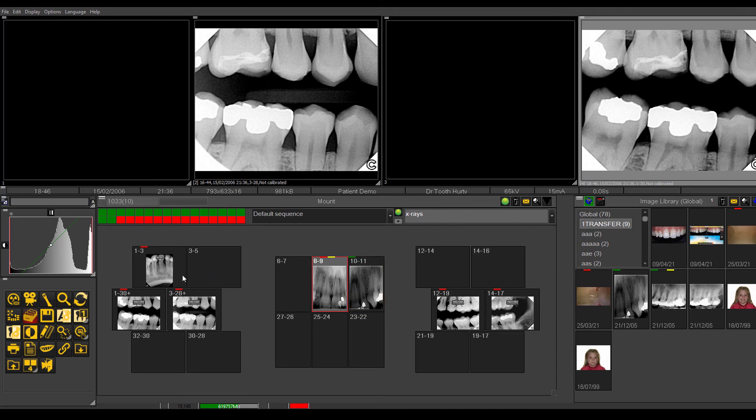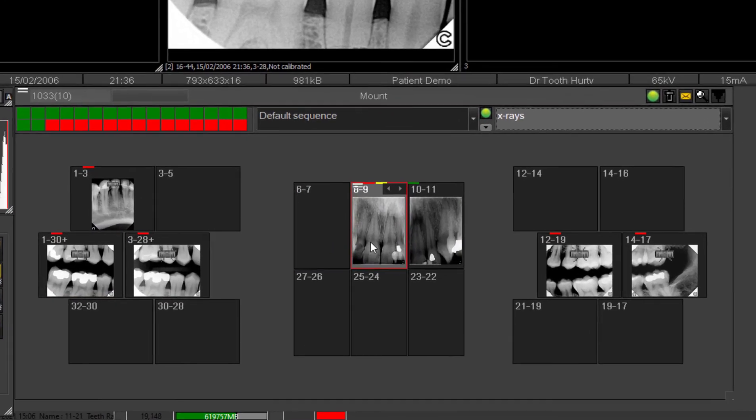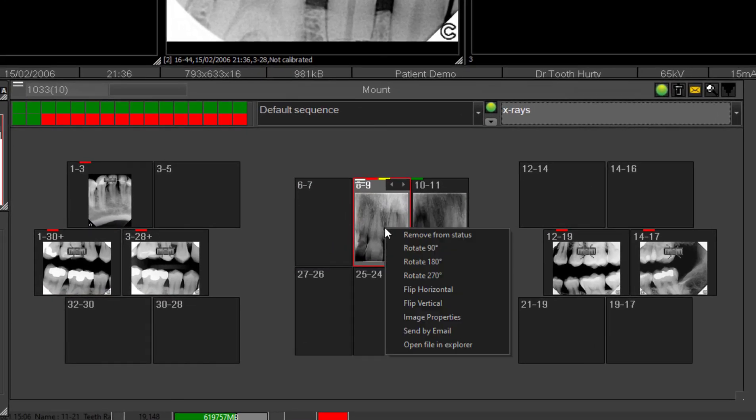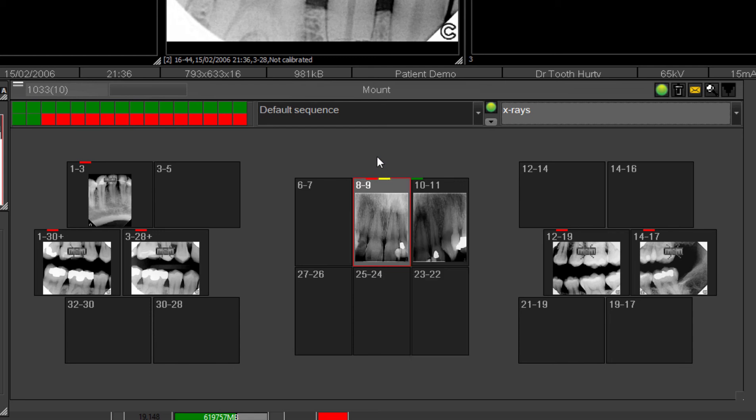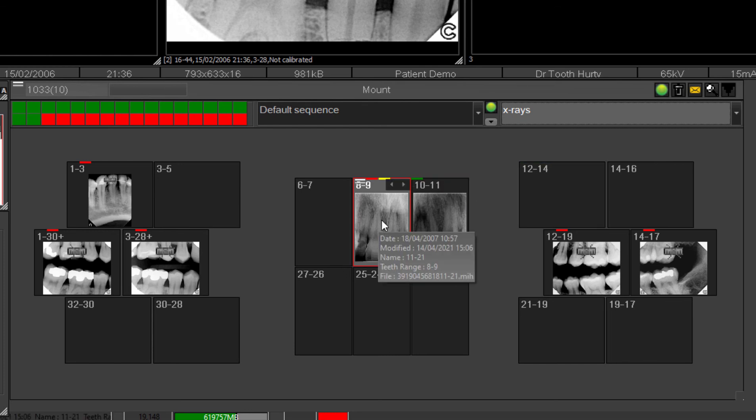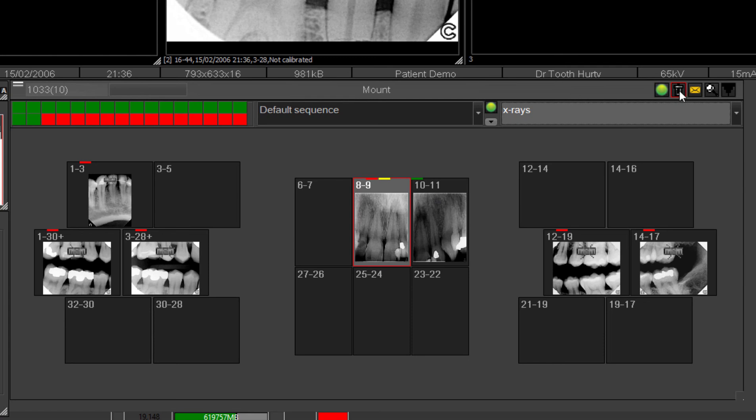Any of these images as well, you can right mouse click and you can send by email if you want to send them out of the software. So in regards to deleting, that's really the way that you can delete images, you just drag and drop them on the trash can and they will be deleted.